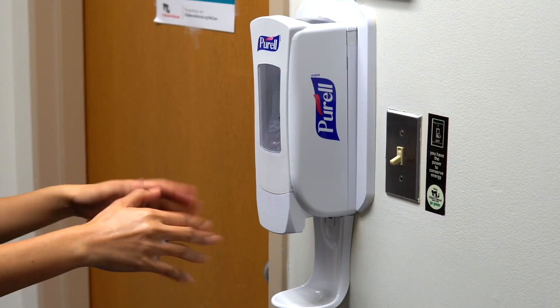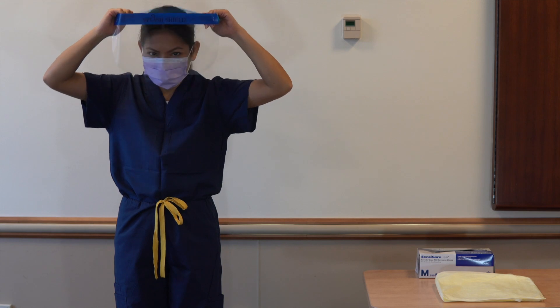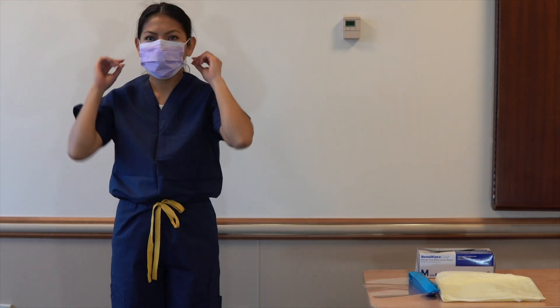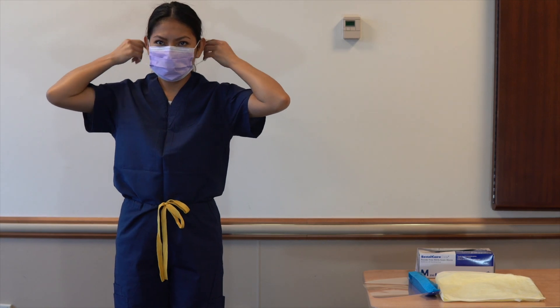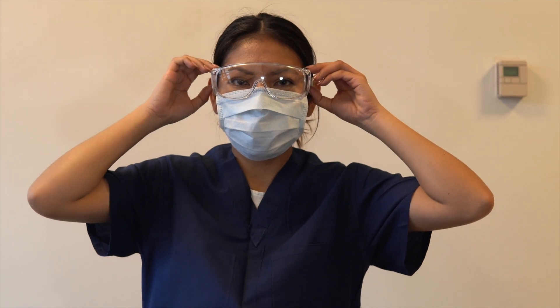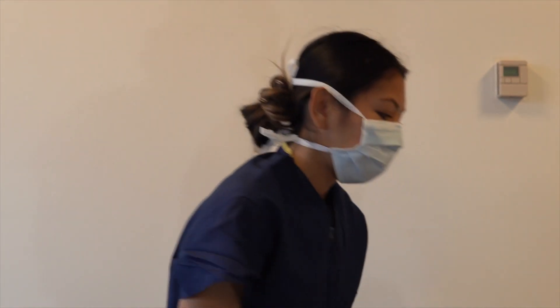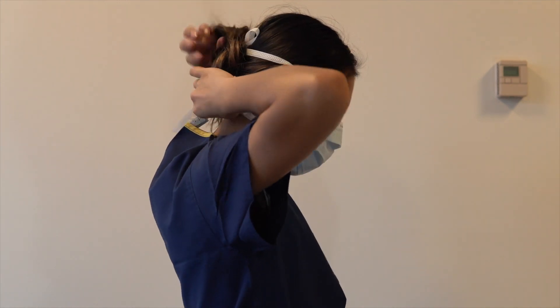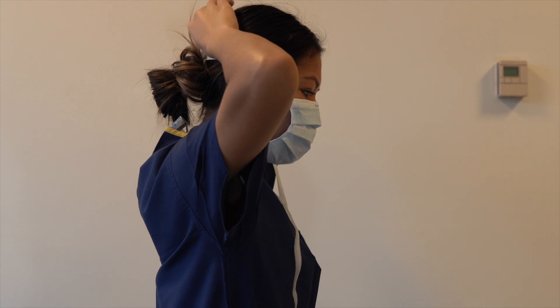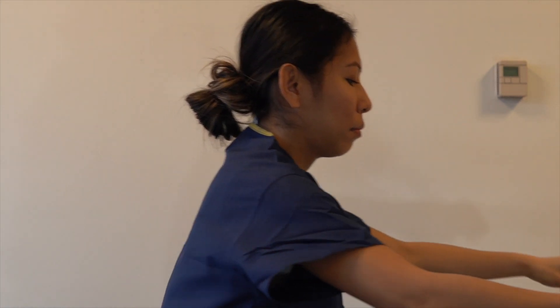Doff eye protection and mask. The outside of goggles or face shield and front of mask are contaminated. Remove goggles or face shield from the back by lifting from back. For ear loop mask, grab the elastic strap by ears to remove. For surgical mask, remove bottom strap first, then the ones on top, and remove without touching the front.